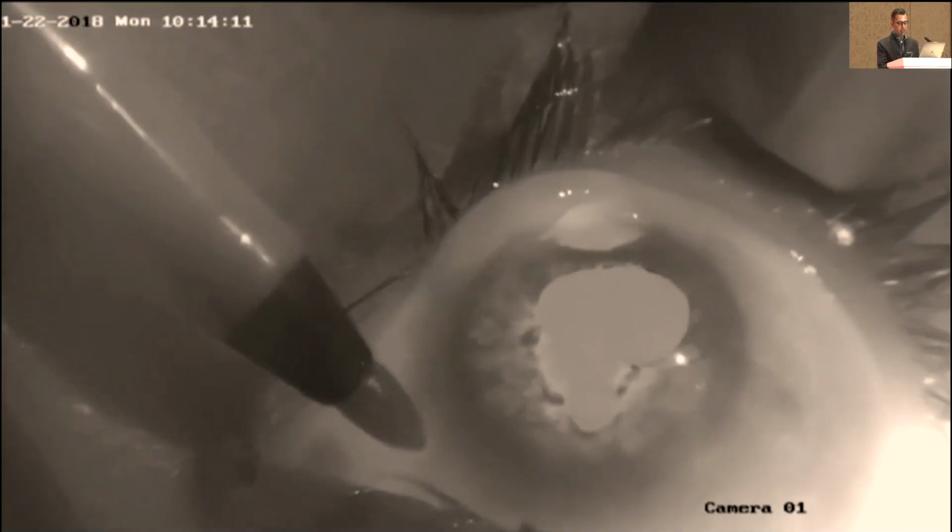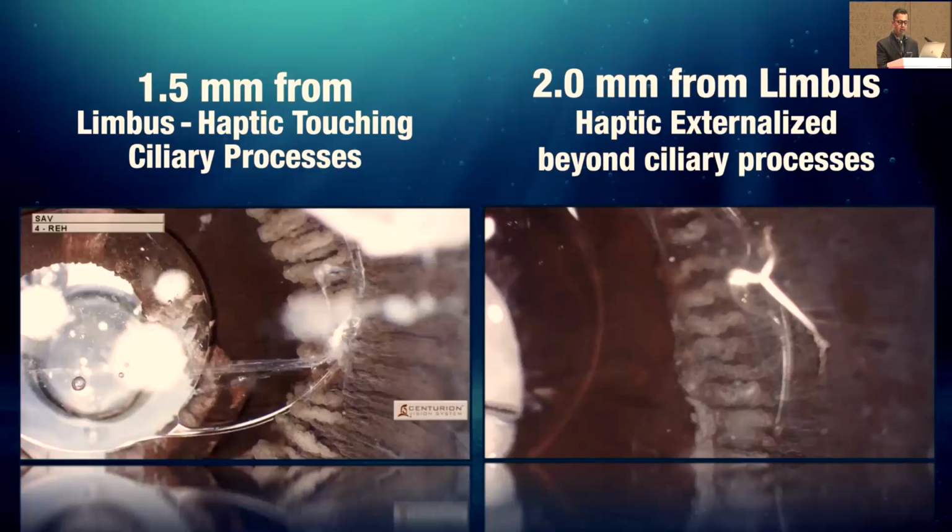So with this technique in mind, we must understand that if we can somehow work this through in our clinics and try to fix the lens just a little more posterior, maybe we'll have happier patients with fewer complications in the long term, and maybe these surgeries can also become image-guided.